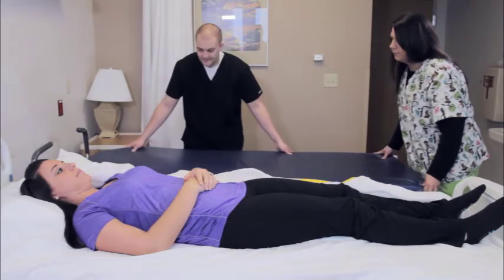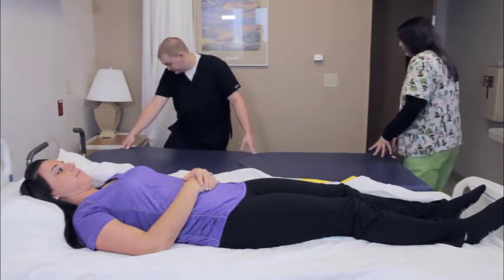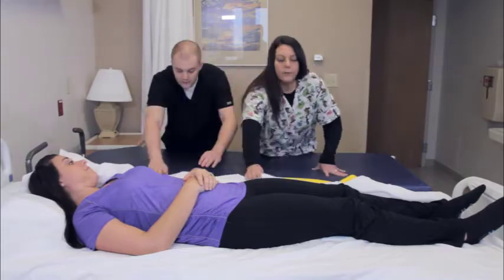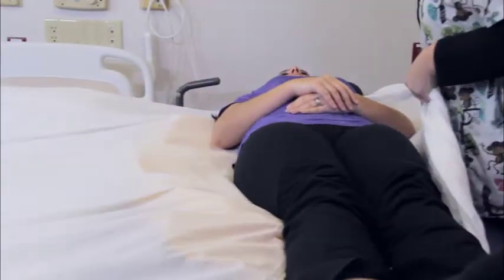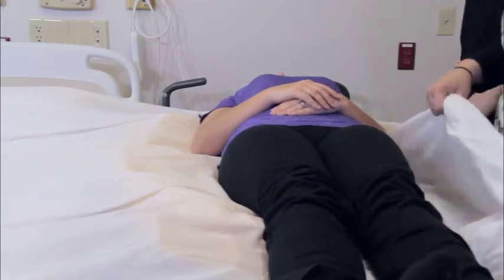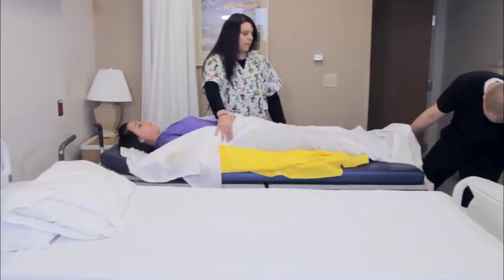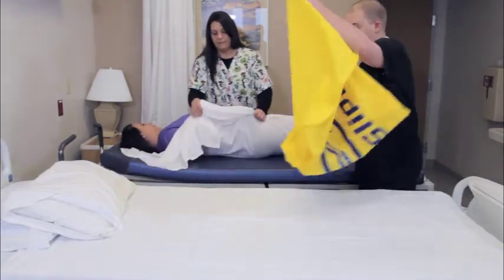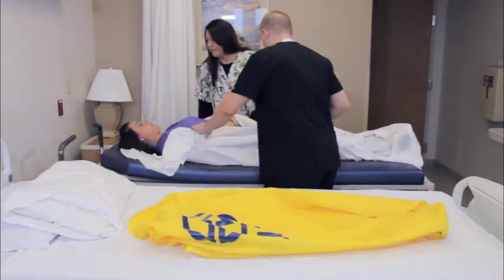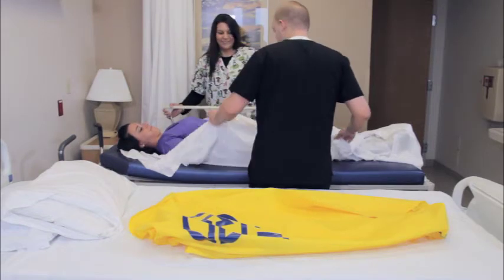Position the gurney next to the bed and lock both the bed and the gurney into position. To complete the transfer, simply pull the sheet gently towards the gurney. The patient glides easily across the slip to the gurney. Unlock and separate bed and gurney. Roll the patient to her side and remove the slip. Raise the gurney side rails and the patient is ready for transport.